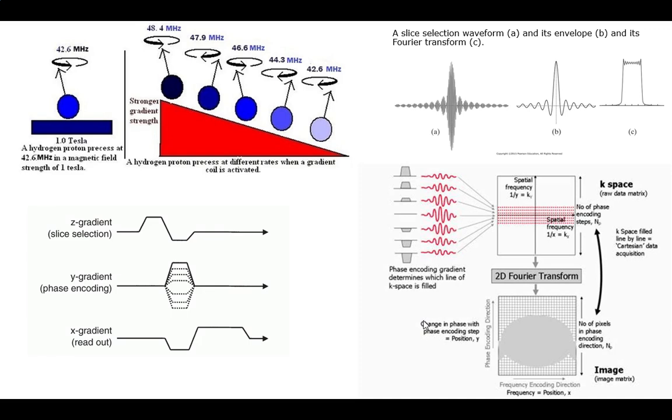So basically how you set this dephase will tell you how much time to make before you read this out. I see. Right? And so this is going to set them to be in the Y direction, back to front. It's going to set them, so some of them are dephasing faster, some slower, and it will be based on the height, or posterior and anterior direction, inside the body. It'll set them to be dephasing at different amounts.